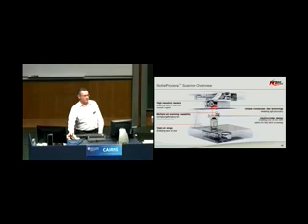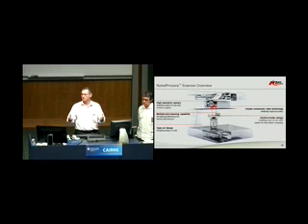So the laser is very controlled in that there's a series of mirrors here. The laser comes down there, hits, and the computer decides how many mirrors need to be involved based on what you've told it you're trying to scan. So it can incorporate 1 mirror, 2 mirrors, 3 mirrors, 4 mirrors. The computer decides how many mirrors it needs to incorporate to capture the information that it needs to. And the laser is then sent down to the model, back up to the receptors, and then transferred across to the computer. It is an open-air design.